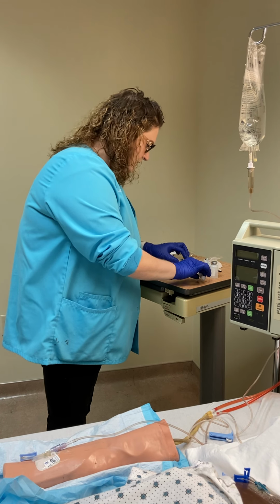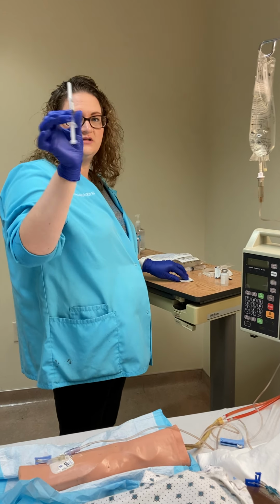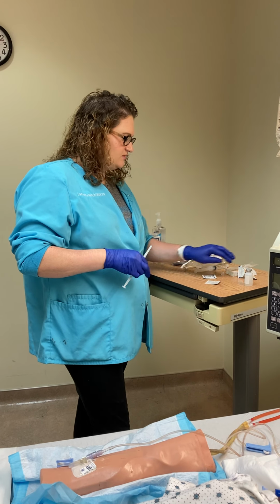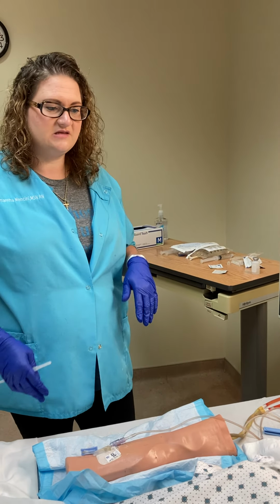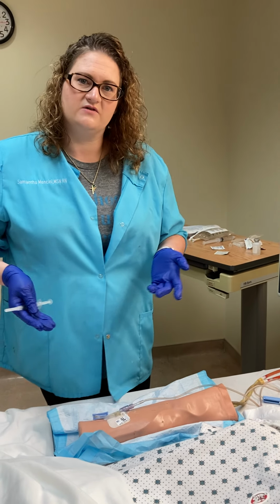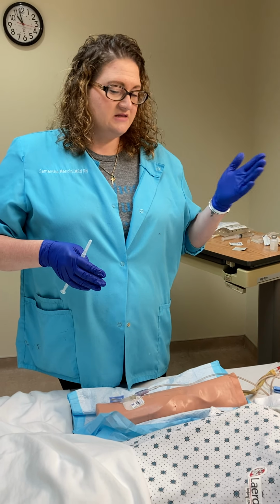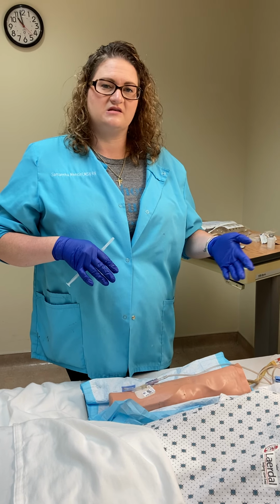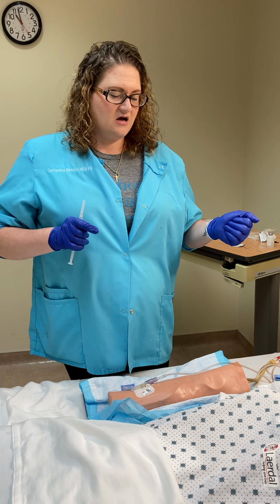Okay. So I prepared my 2 milliliters and I have labeled it. And I'm going to go to his room, get his name and date of birth, allergies, any pre-assessments for Zofran. He's complaining of nausea. This is an as-needed medication. He can have it every 6 hours as needed.